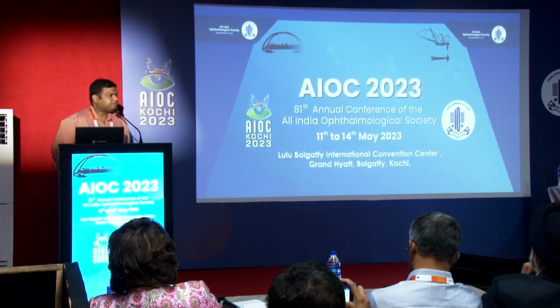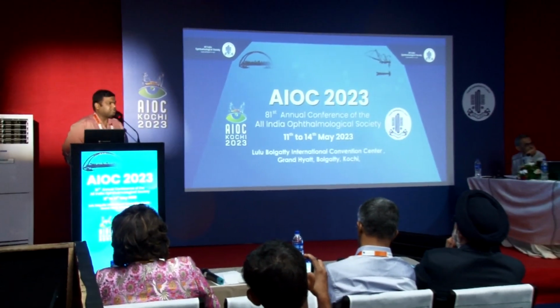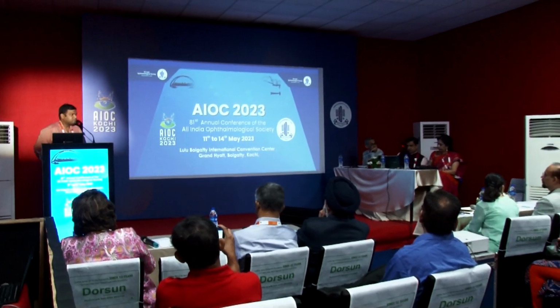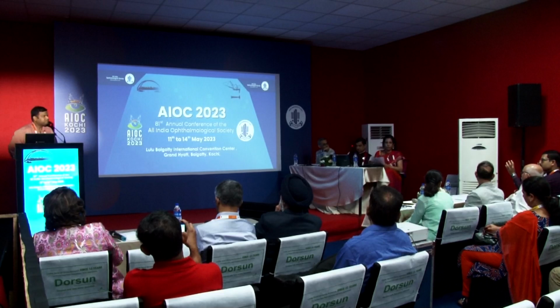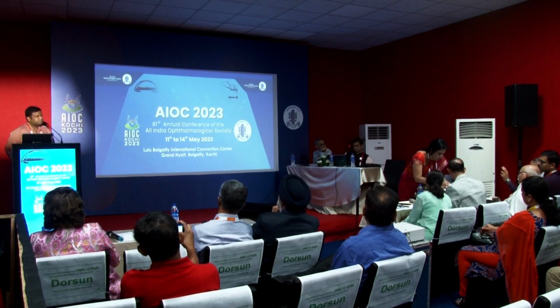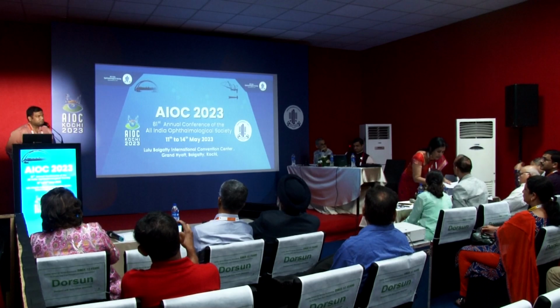Essentially, what you're doing is you are minimizing the magnification that happens at the retina end. Yes, because this machine is not tailor-made to be working with a wide field. The beam is the same, right? The concentration of the beam is the same. So since you are compressing it, it is scanning a wider area. Yes, sir. Since the machine is not tailor-made to do this job, perhaps it is better to compare it head-to-head with the machines that are already tailor-made to do this job.